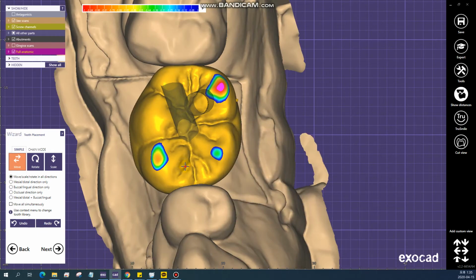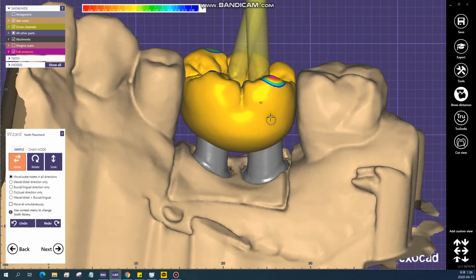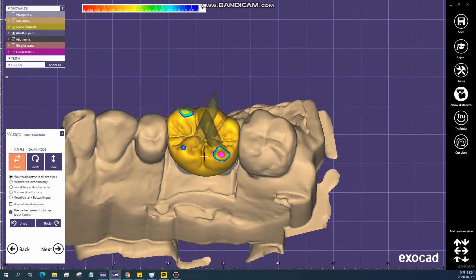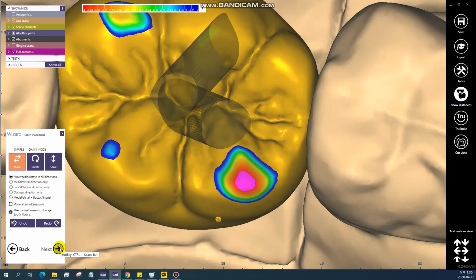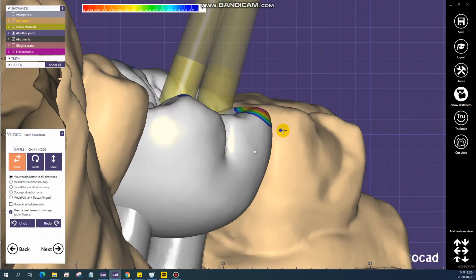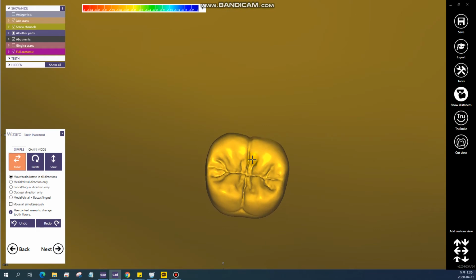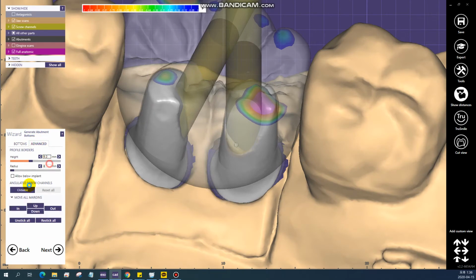Okay, here's my library. If you guys want it, I can give it to you for free. I made it, but it's not good enough for chain mode, but I can use it, and I really can save my time. Okay, here's the thing. Here I'm going to add a little more in length, but you still have to keep contact with each other, and there's no need for extension.